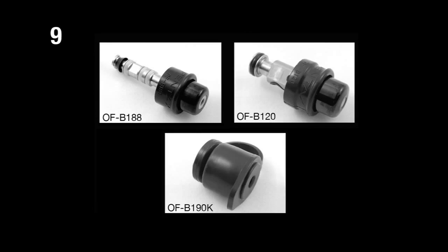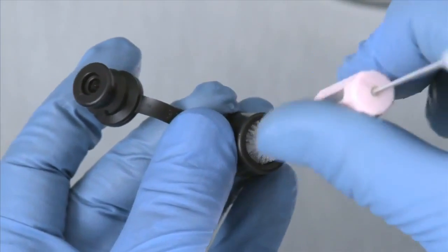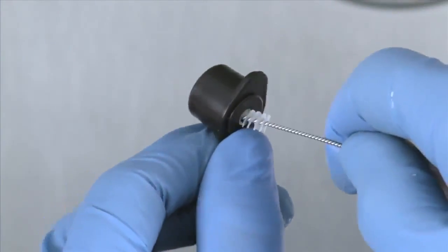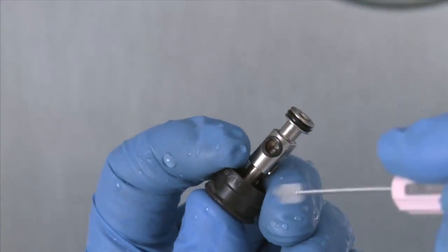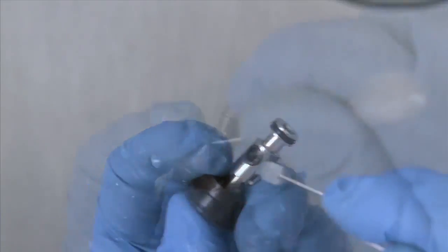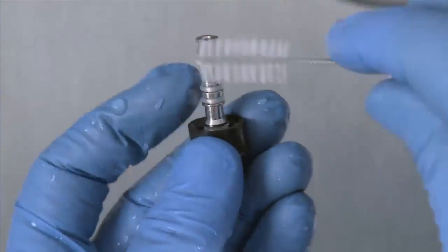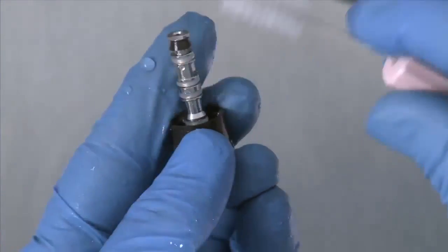Step 9. Clean the endoscope's components. Clean and brush all the endoscope components one by one as described in the PENTAX Reprocessing Manual, making sure to depress the valves to access recessed areas. Inspect the O-rings prior to use and replace any that are chipped or damaged. Replace the worn or damaged items to avoid spitback and/or leakage.